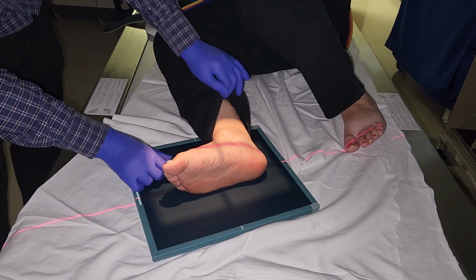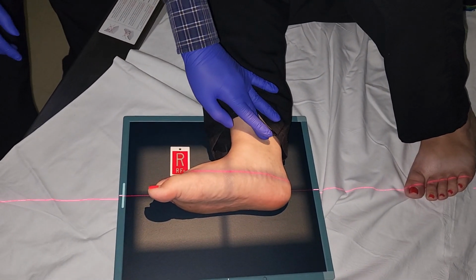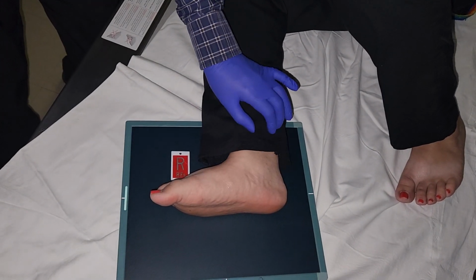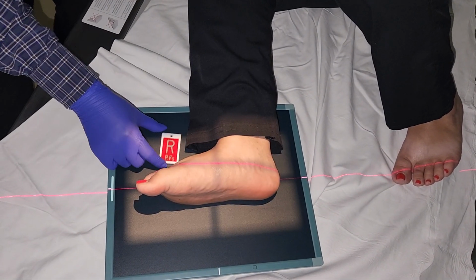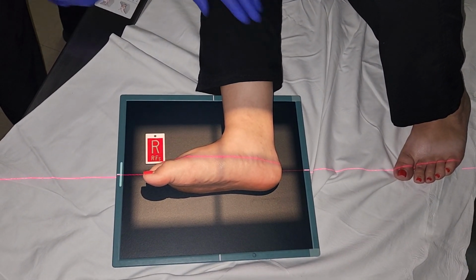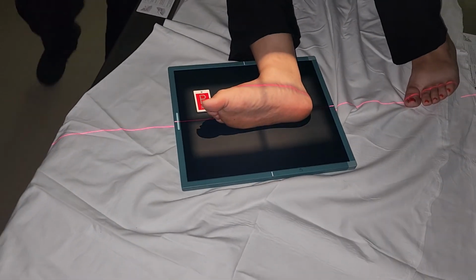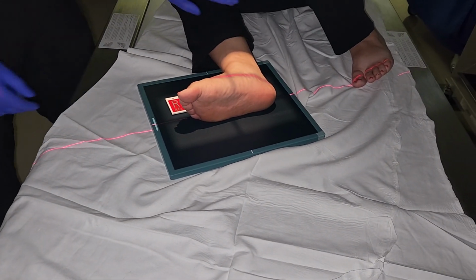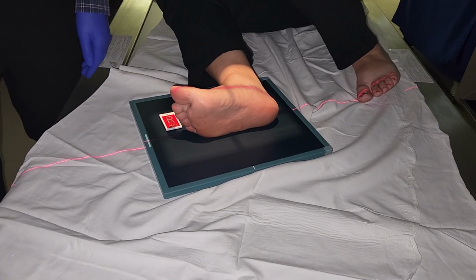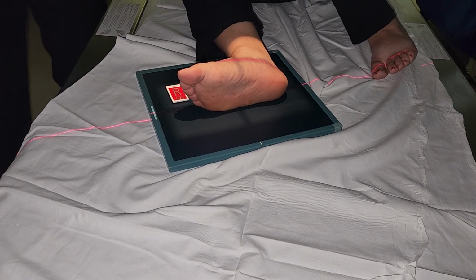Make sure you do catch the malleoli here. You don't want to collimate so much that you clip the malleoli. So catch the malleoli, catch the distal tibia and fibula, and then the marker goes here. So in this case you would just pull your pencil over. Okay, so that's your lateral foot. Also, when they dorsiflex, try not to let them bend their toes all the way back like this. Try to get them to relax their toes so that everything is nice and straight.